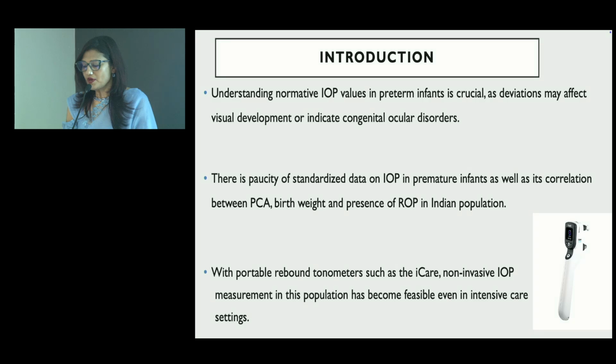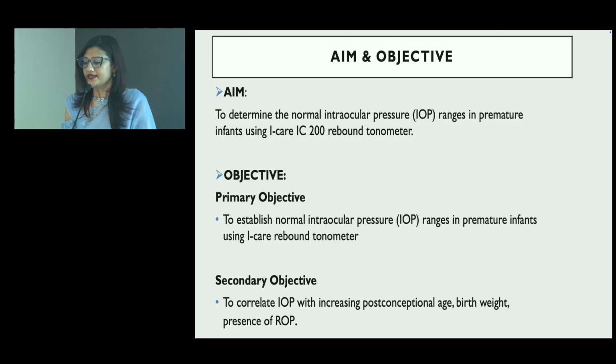With a portable rebound tonometer such as the iCare, non-invasive IOP measurement in this population has become feasible even in the intensive care NICU setting. The aim was to determine the normal intraocular pressure range in premature infants using the iCare 200 rebound tonometer.